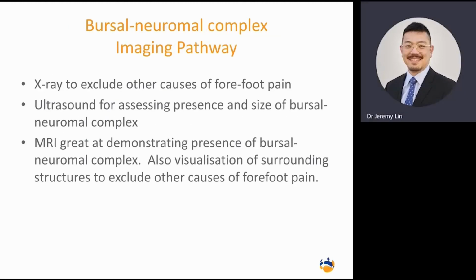So in terms of imaging pathway, X-ray is a little bit limited in what we can see. We can sometimes see splaying between the affected metatarsal heads if the bursal neuromal complex is large enough. Again, what it is useful for is to exclude any other underlying causes.